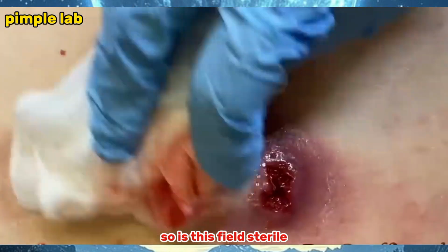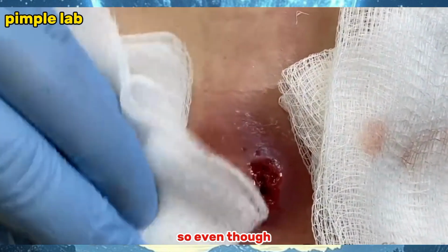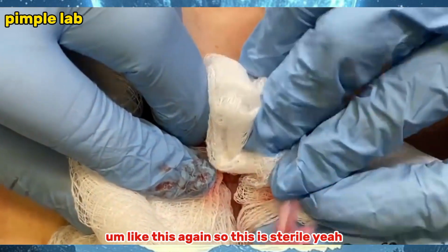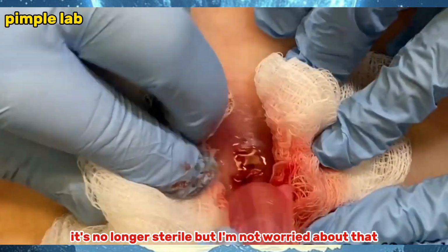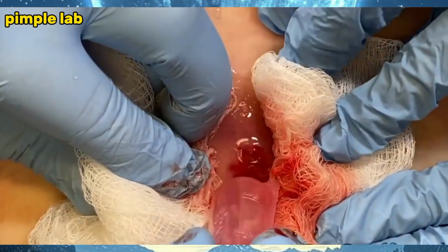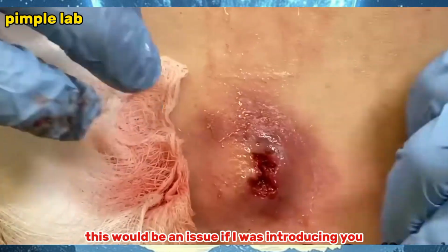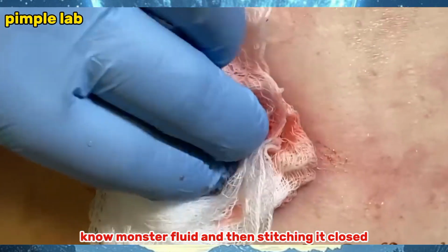So is this field sterile? No, it's been compromised since the beginning. Even though we'll try to maintain a clean environment, like this, this is sterile, but obviously when you can see it went into the actual syringe, it's no longer sterile. But I'm not worried about that because this whole area is compromised, and as long as it's open, it's going to drain itself out. Now again, this would be an issue if I was introducing non-sterile fluid and then stitching it closed.